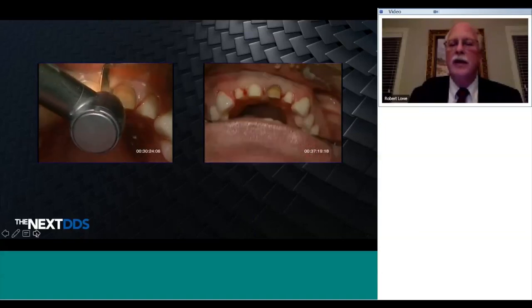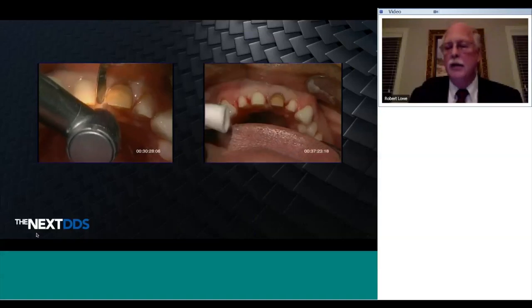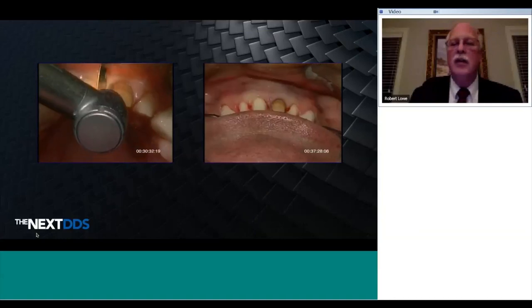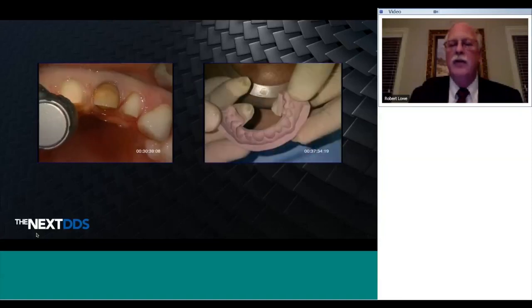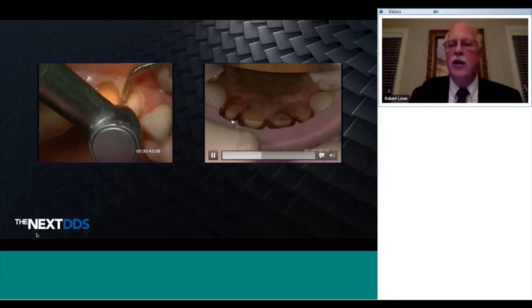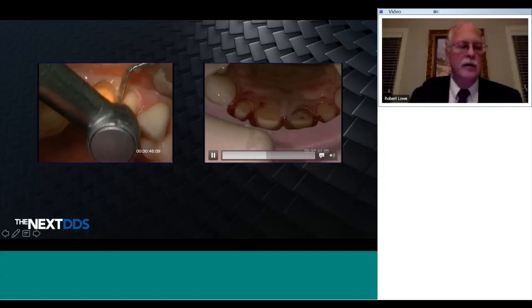I always do a preoperative wax-up, and from that wax-up, I'll make some type of preparation guide. The preparation guide may be out of addition silicone, which you'll see here, which I make some cuts in, and then I can get a three-dimensional idea of where the final restoration will be, again as a check and balance here to make sure I have enough reduction in these critical areas.